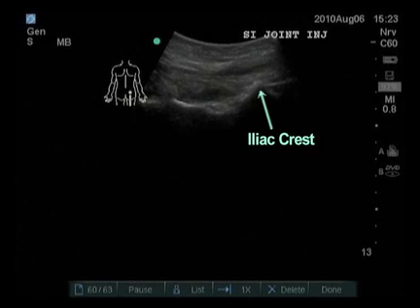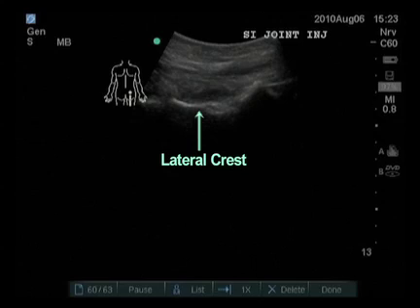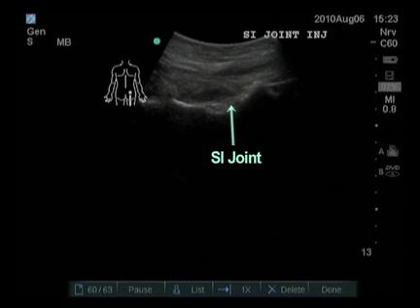The iliac crest is visible as the large hyperechoic structure on the right of the screen. The lateral crest of the sacrum is visible below. The target is the void between the lateral crest of the sacrum and the iliac crest. This helps solidify understanding of the three-dimensional structure of the sacroiliac joint.